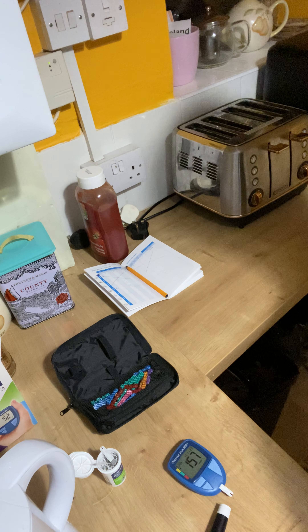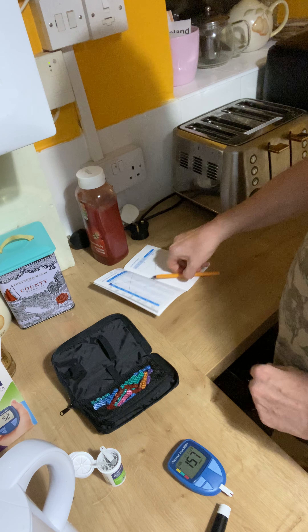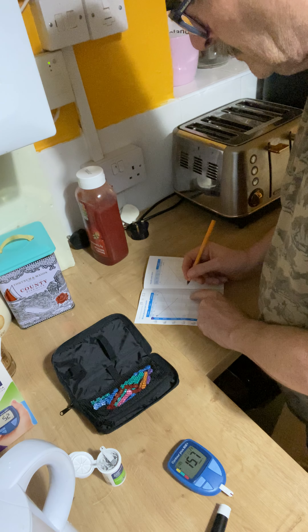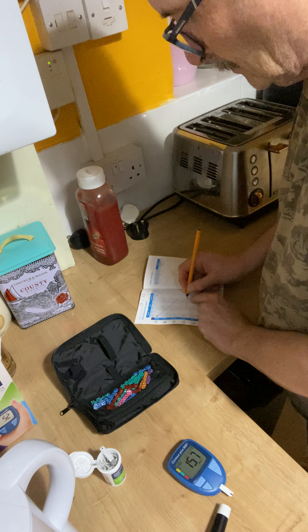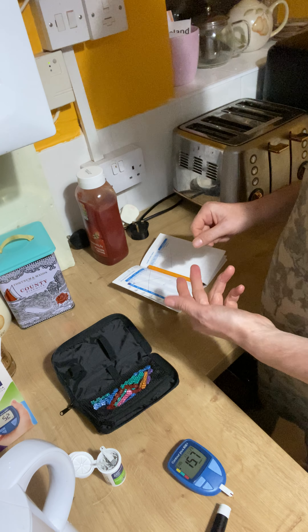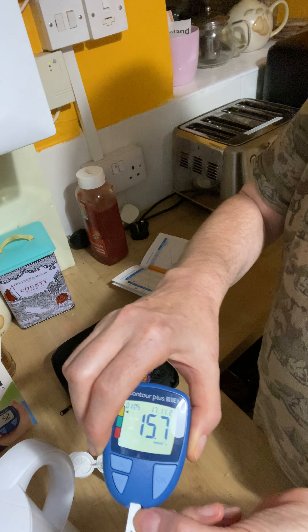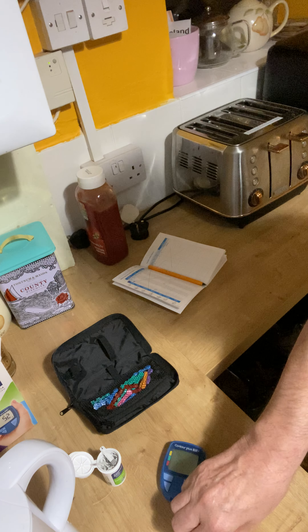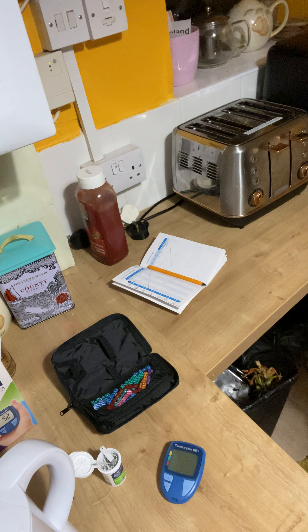It's high — oops, oh well. Alright, and you pull this tab out and you're finished, it goes off. You can take the needle out of here and put it into a safe place.